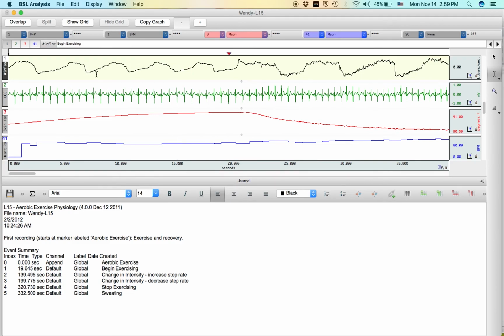Similarly, the inhale dips down to here, and then as we approach 0, that's where the inhale stops and the exhale begins. So there's a small pause in between those two actions shown here where the rate in liters per second approaches 0. So just to highlight it and show you, that is one exhale, we get to 0 again, and then we have an inhale. So one up and down is one exhale and then inhale.